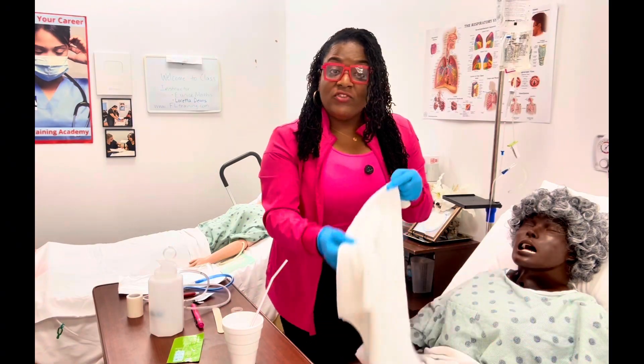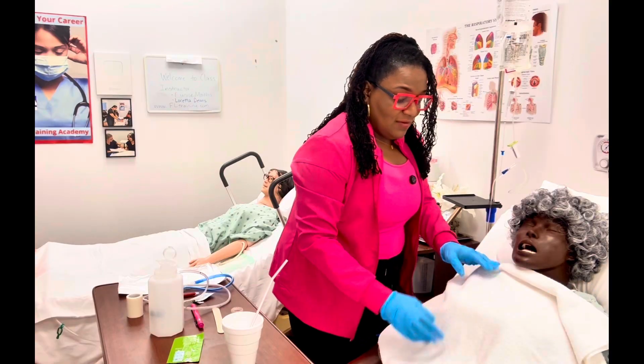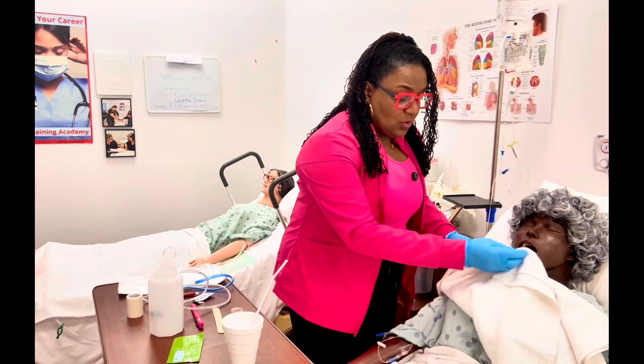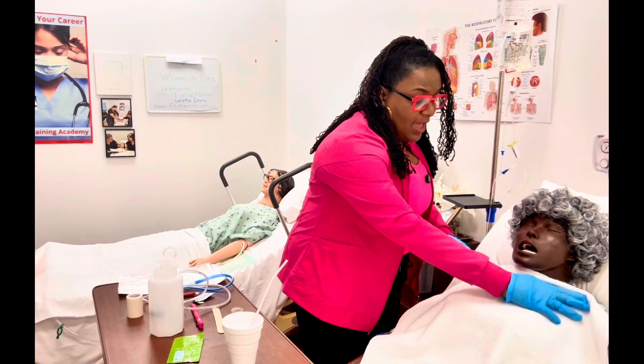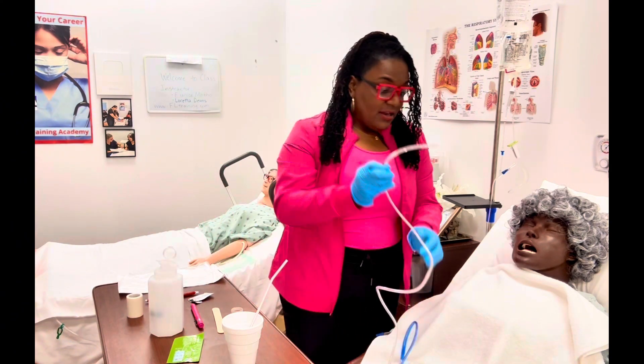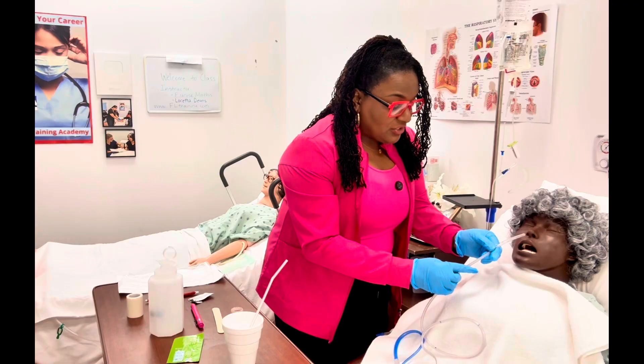Now that everything is measured, I'm going to put a towel on my patient's chest. Sometimes patients feel the need to vomit, so I want to have a basin nearby, and I can also use the towel to wipe their mouth afterwards — it protects their clothing just in case. Now that everything is lubed, I'm going to go ahead and insert.